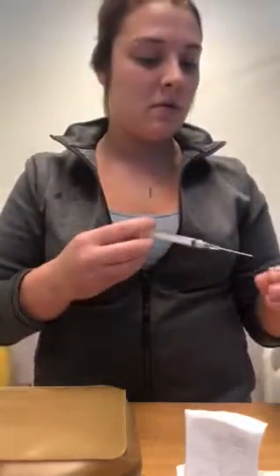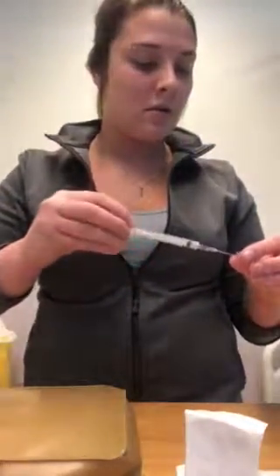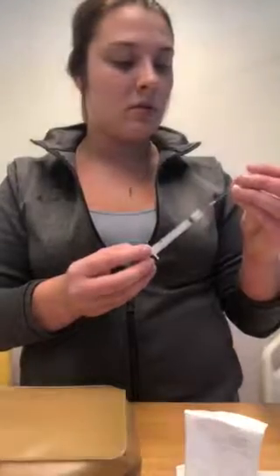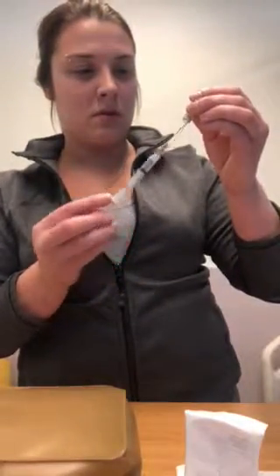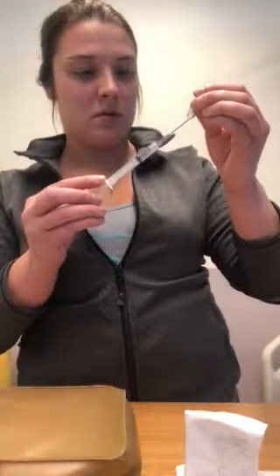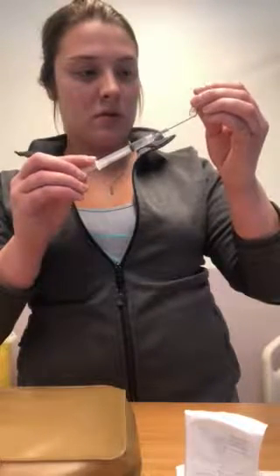Sorry, just before I started that, I just want to make sure that I get my syringe so it's not sticky. Okay, I'm going to put this in my sharps.